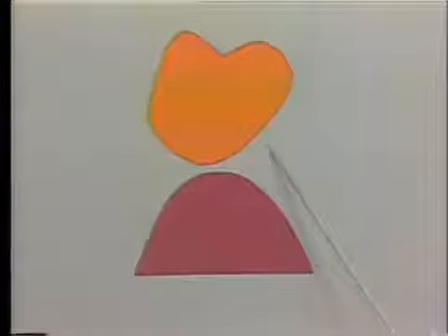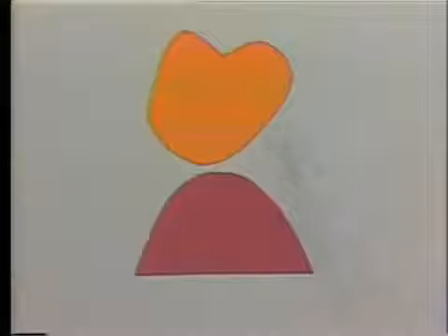This, of course, helps in opening the embrasures, both the lingual embrasure and the proximal embrasures on the lingual surface, and gives much better access in here for cleansing of the Pontic itself and stimulation of the soft tissue in this region here. The relationship of a posterior sanitary Pontic to the alveolus is shown in this diagram.